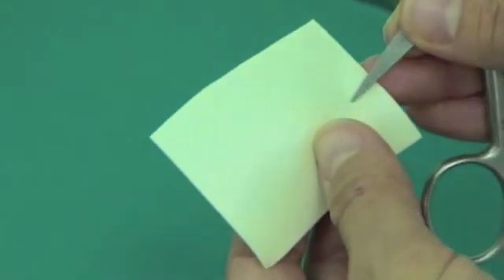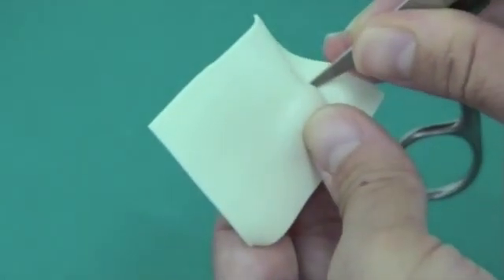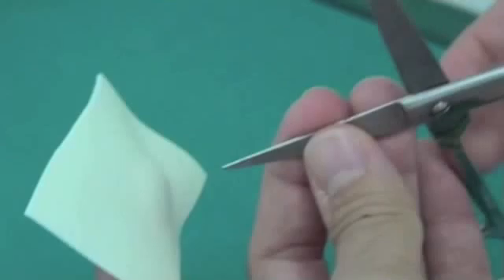Before starting the exam, the adhesive patch is prepared to be modeled according to the size of the nostril.